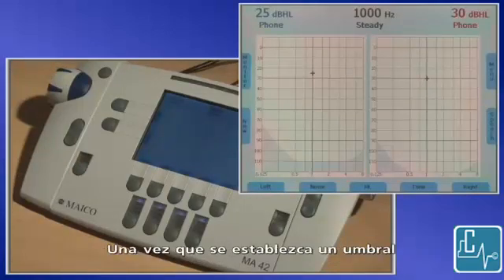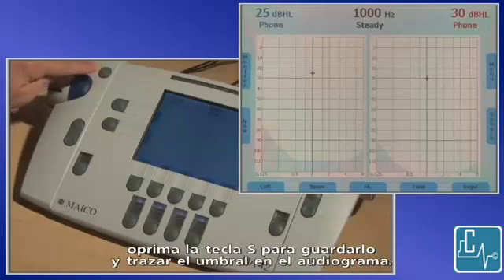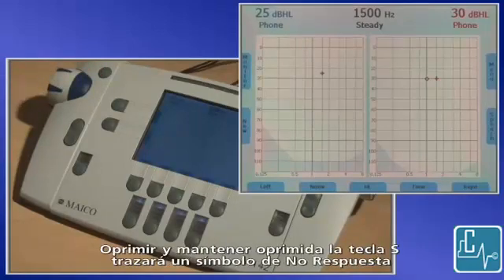Once a threshold is established, press the S key to save it and plot the threshold on the audiogram. Pressing and holding the S key will plot a no response symbol.